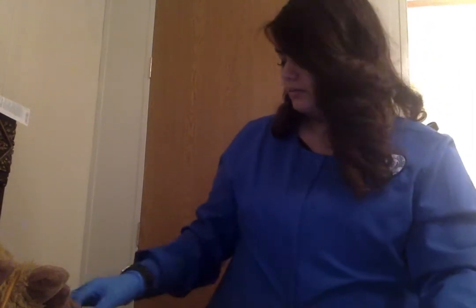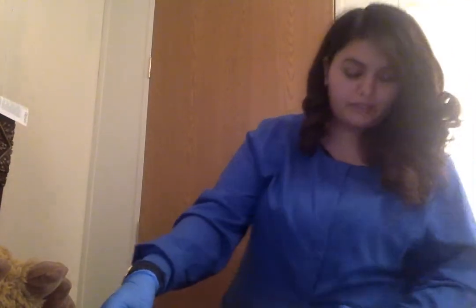So what we're going to do is we're going to take a syringe and we are going to empty the balloon. If I can find the syringe, what did I do with it? Crazy girl. Oh no, did I throw it away in the big trash over here? Oh goodness. Where's it at? Okay, I found it.